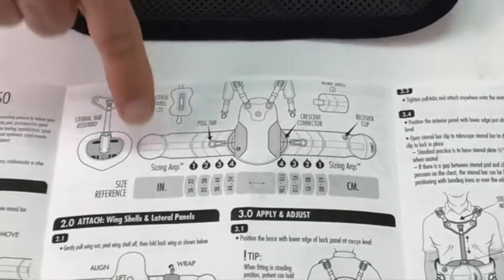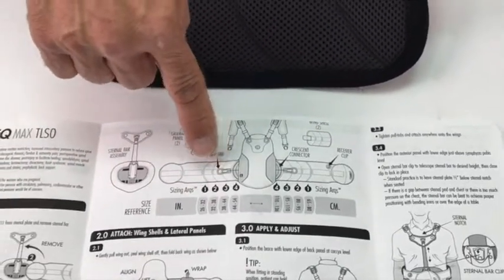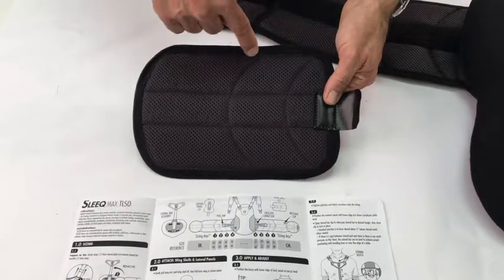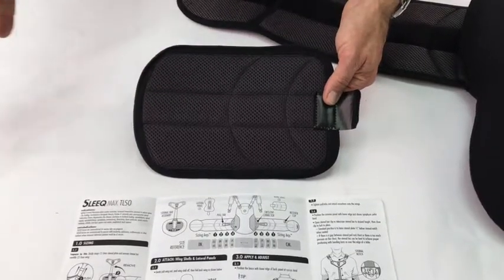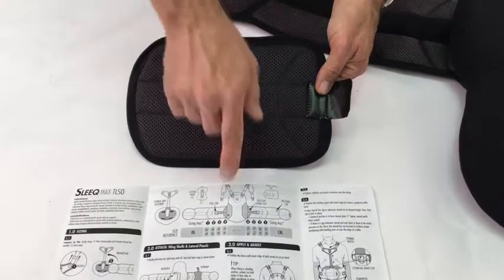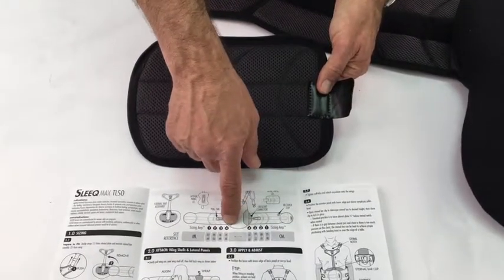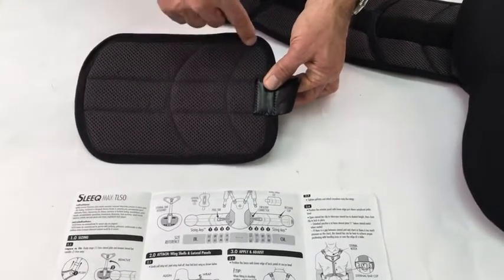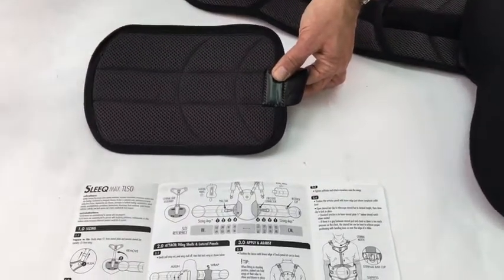For sizing arcs one, two, and three you're going to use the center arc on the shell — on smaller patients you have less panel going around the body. For sizing arc number four, for larger patients, you're actually going to use the posterior sizing arc to get more panel around the body.